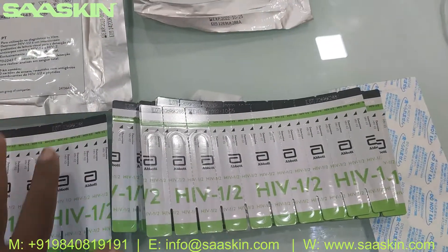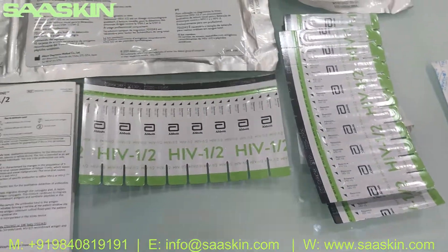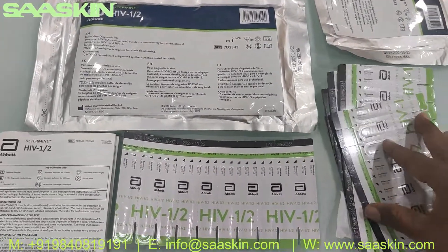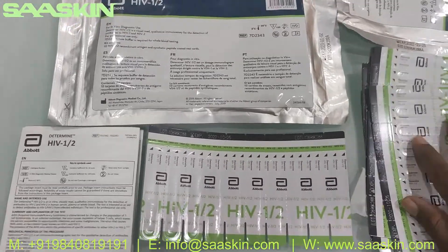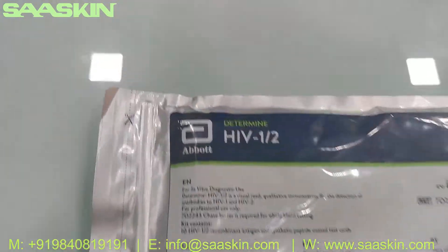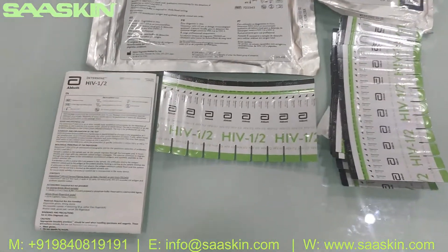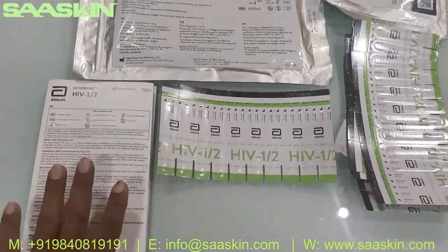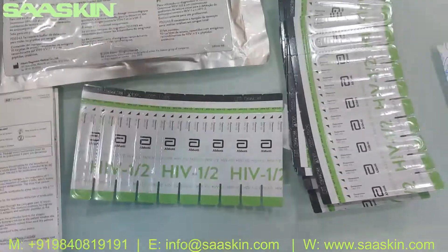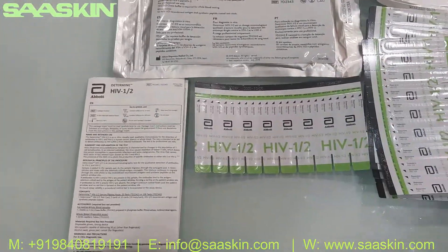This is how the total kit looks — 10 packs in total. To quickly summarize: in the Abbot Determine HIV 1/2 antibody test kit you get an IFU brochure and 100 test strips with 10 pieces in each pack. That is the complete contents of the total pack.